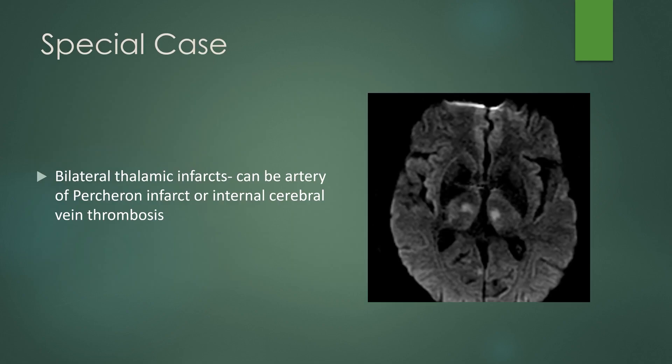Special case: if you have bilateral thalamic infarcts, this can be related to an infarct of the artery of Percheron, which is very difficult to see as it is very small. But don't always assume it's arterial — internal cerebral vein thrombosis can also present with venous infarcts of both thalami. Keep both in mind and always look at the internal cerebral veins when you see bilateral thalamic infarcts.